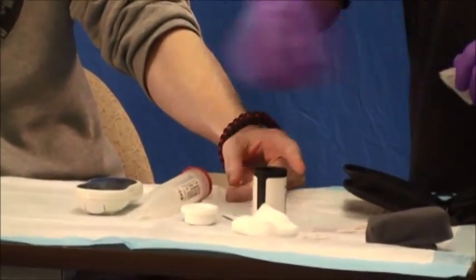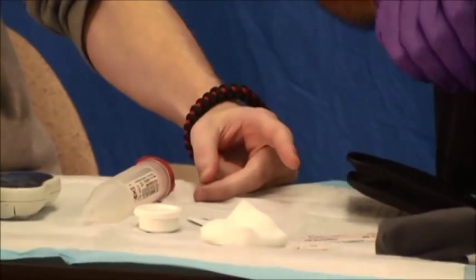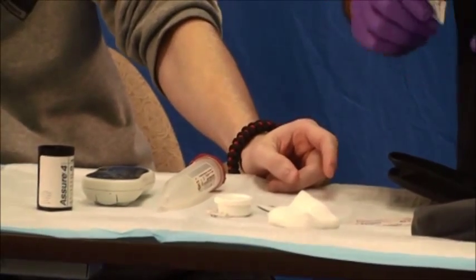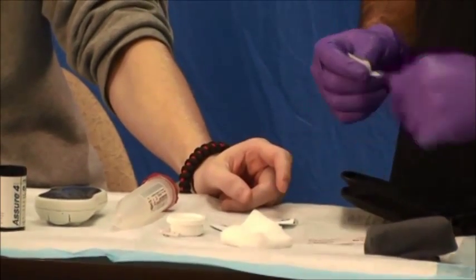Ensure that you have all your equipment assembled, including your glucometer, your strips that are coated correctly, a sharps container to throw away your lancet, alcohol prep pads, as well as something to clean the first drop of blood with.